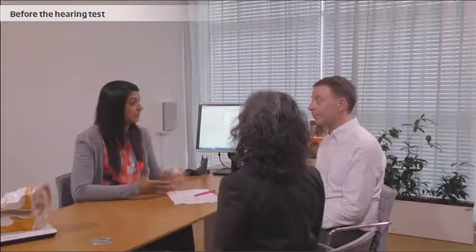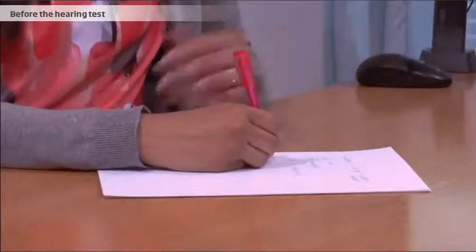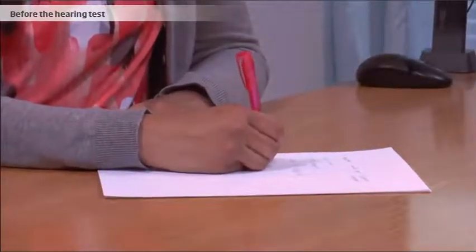Before any hearing test is conducted, the hearing care professional engages in a dialogue with the client in order to know as much as possible about the client's background regarding communication challenges and hearing needs. This provides a holistic picture of the client's listening needs and other factors that may contribute to how the client perceives sounds. It also indicates if any specific considerations should be taken into account when performing the hearing test.